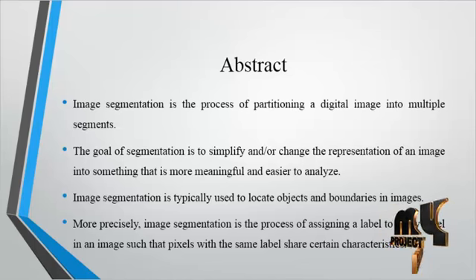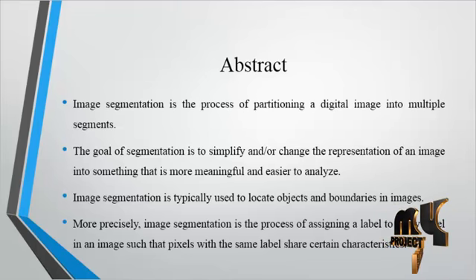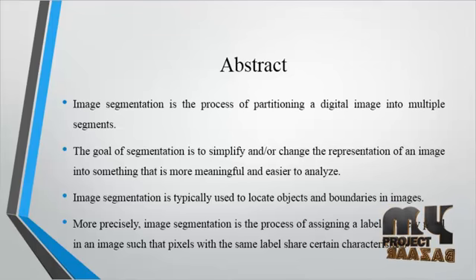In this process, the early detection of brain metastasis increases the survival of patients with cancer, since image guidance is most widely used for treatment. As a support for quality diagnosis, radiologists may use computer-assisted tools that provide quantitative and reliable analysis. This article reviews the methods for automatic detection of brain tumors using magnetic resonance images and the contrast enhancement by T1 weighted magnetic resonance images.